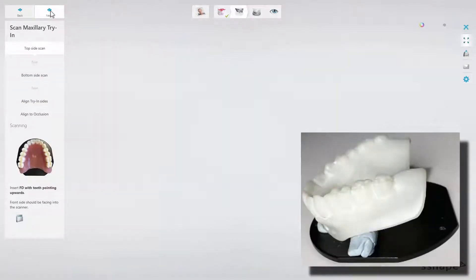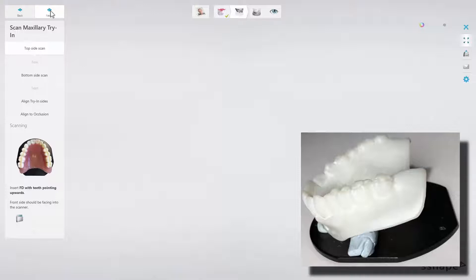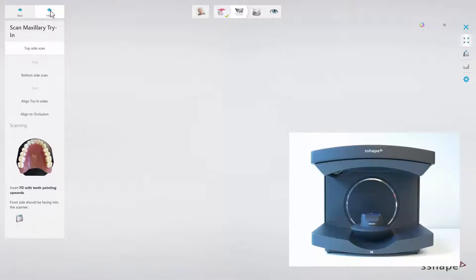Mount the upper try-in having the teeth facing upwards on the scanning plate using BluTac. Put the BluTac under the front teeth only during placement and angle the denture in a way that the posterior teeth are higher than the anteriors. Then insert the plate into the scanner.